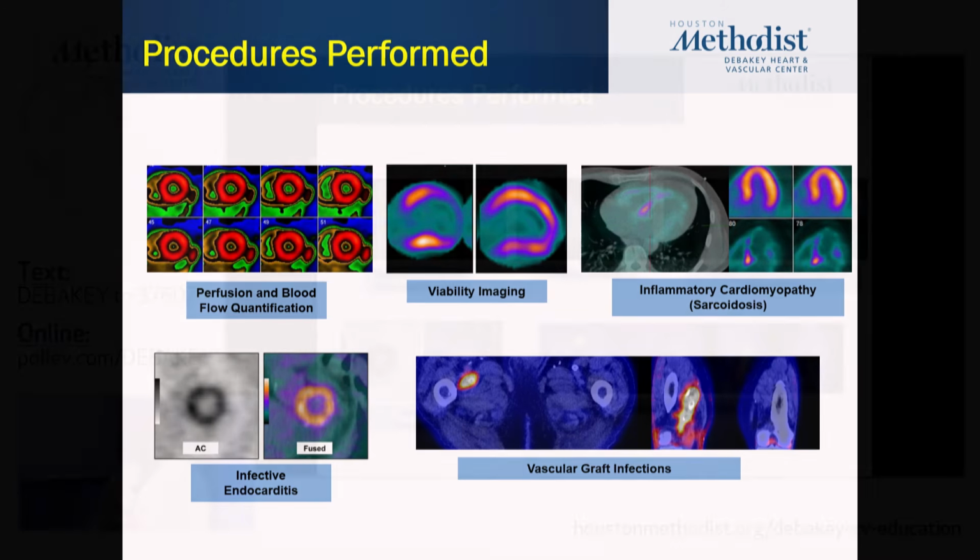So if it is a cancer, you want to make sure that the cancer will light up, not the normal myocardium, because also, as you see here in the viability image, in viability we will get normal uptake from the myocardium. So what we do is we suppress the normal myocardium and just have the mass light up if it is malignant.